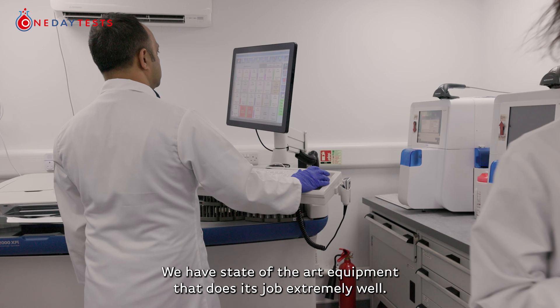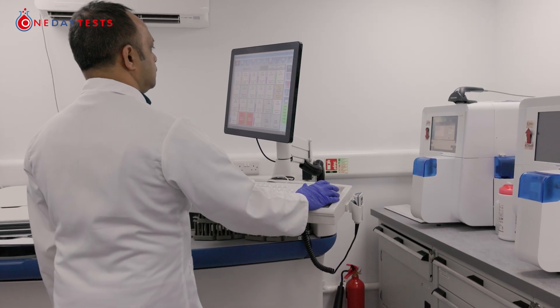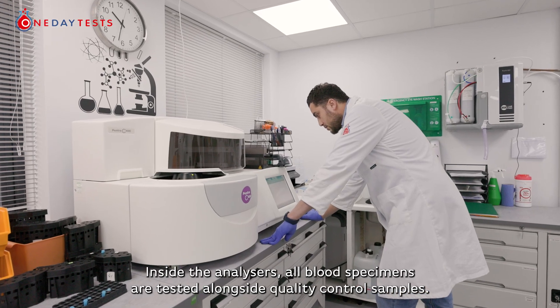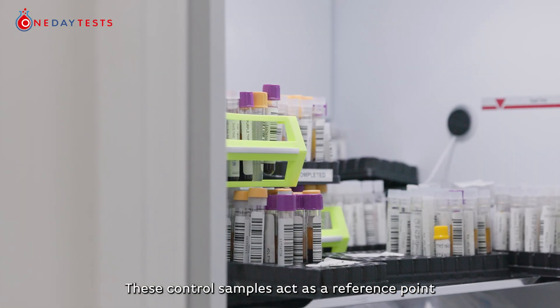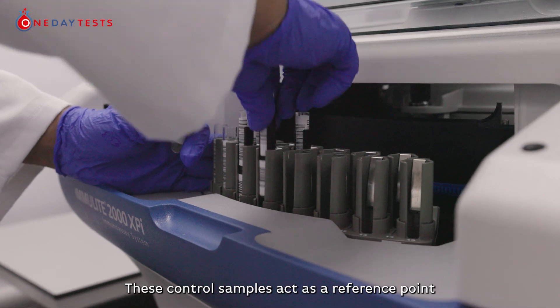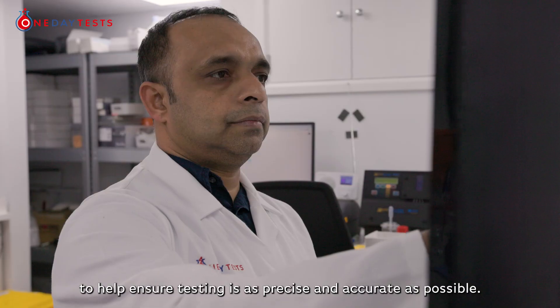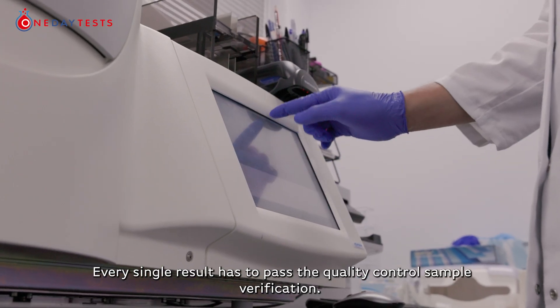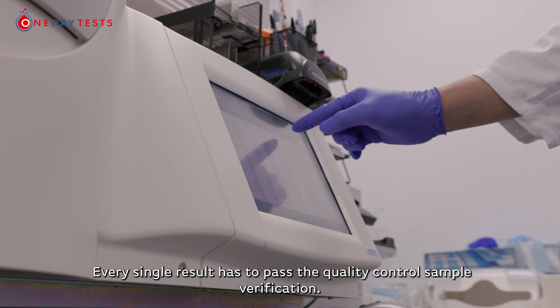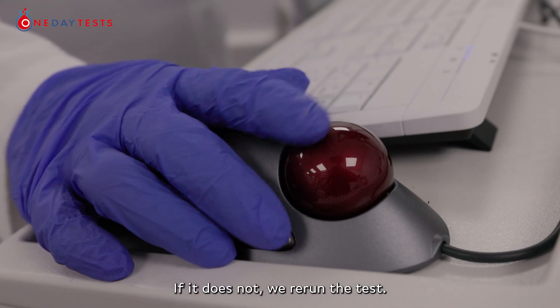We have state-of-the-art equipment that does its job extremely well. Inside the analysers, all blood specimens are tested alongside quality control samples. These quality controls act as a reference point to help ensure testing is as precise and accurate as possible. Every single result has to pass quality control sample verification. If it does not, we re-run the test.